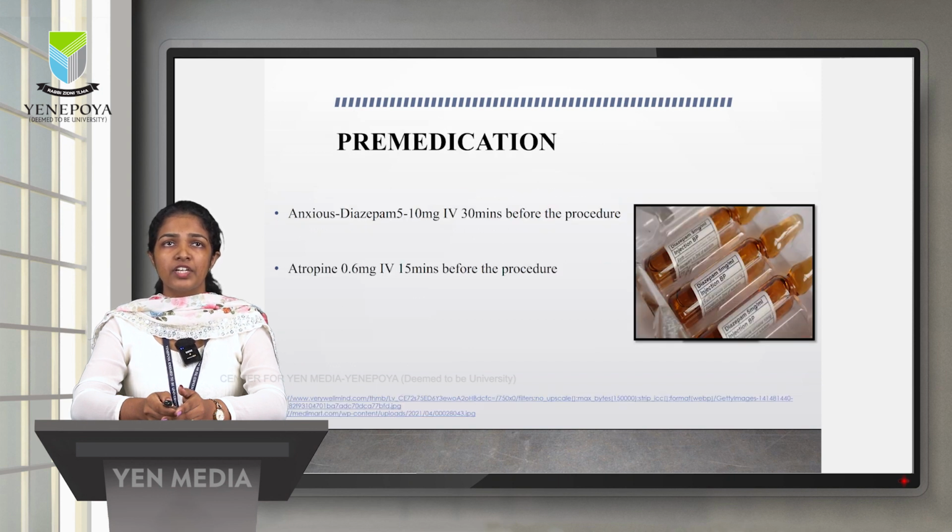Coming to the pre-medication, if the patient has any anxiety issues, then diazepam 5 to 10 mg is given intravenously 30 minutes before the procedure, and atropine 0.6 mg is given intravenously 15 minutes before the procedure.